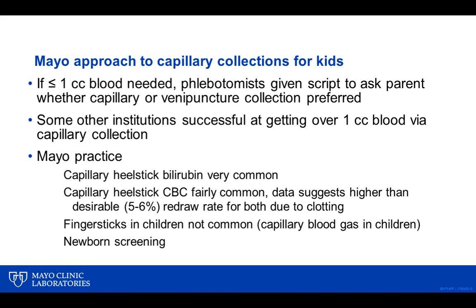So again, if we do a capillary finger stick or a heel stick on an infant, it tends to be less painful, less uncomfortable for the child. If we're going to do a CBC collection, we have a higher chance of having to recollect it, even for a total or direct bilirubin or a biochemical analysis. There may be a higher percent of having to recollect it versus a venipuncture, where we will have less chance of needing to recollect it, but it may be more uncomfortable. We may have to restrain the child more for a venipuncture.